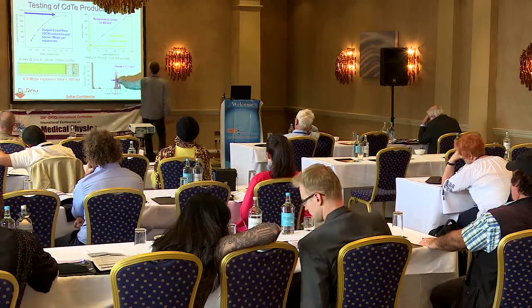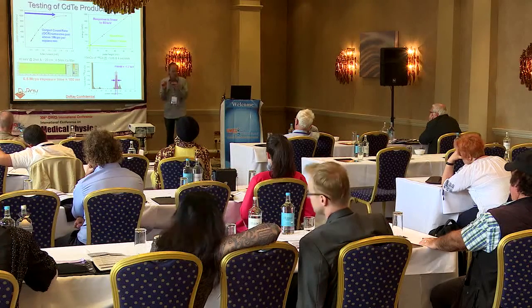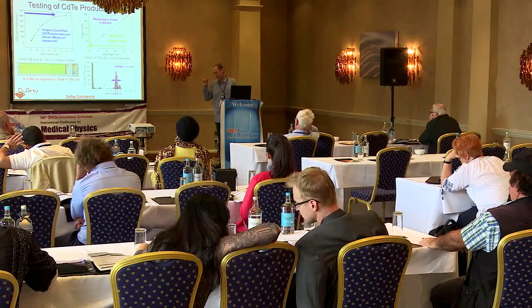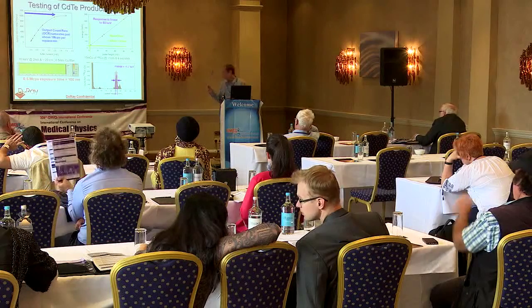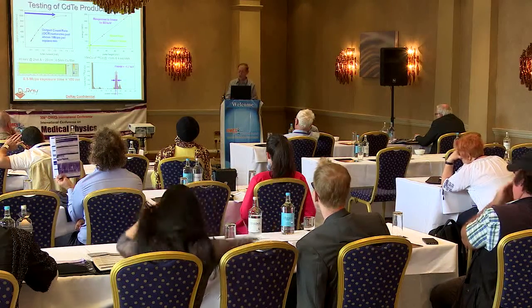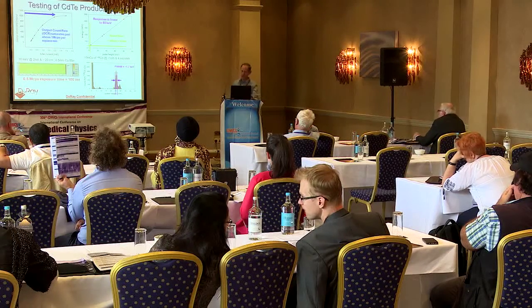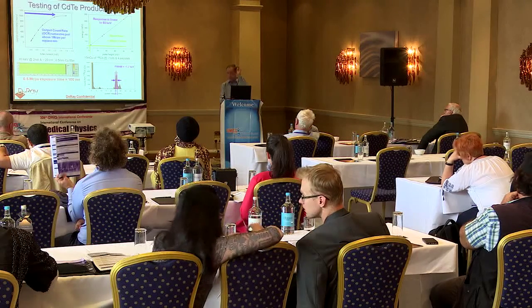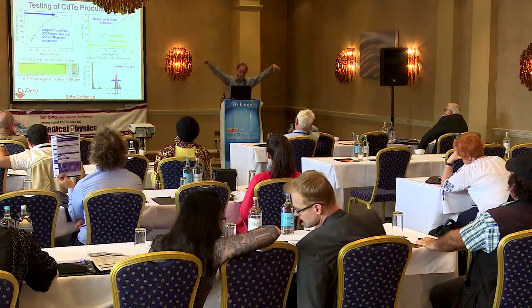These systems have very, very good energy resolution, and this is important. The energy resolution requirement for BMD imaging is much, much higher than it is for spectral CT, and so we have 1.7 keV full width half max. I think this is a record energy resolution for an area array. Cryogenic single cell elements can achieve better energy resolution, but not in a room temperature device with an entire array of pixels.